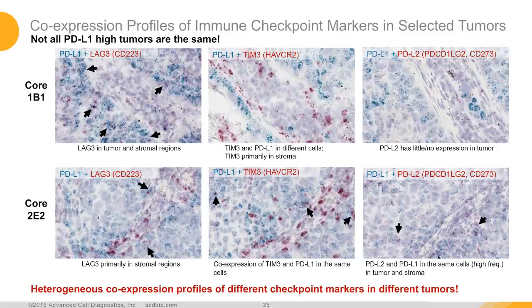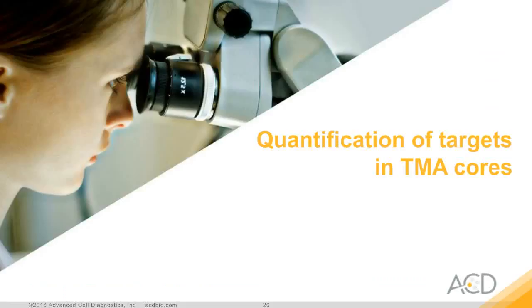Moving forward, next I want to show you another way of analyzing the data. If the investigation requires a quantitative component to draw out additional conclusions, then the following will be of interest. RNAscope data can be analyzed in a more objective and rapid manner using an automated software analysis platform such as Indica Labs' Halo software. In order to speed up the process of counting the number of dots or events in each cell, Halo was used to assign regions, set up parameters, and process the data. This will all make more sense in just a minute.